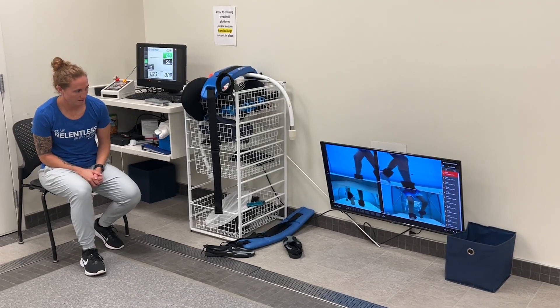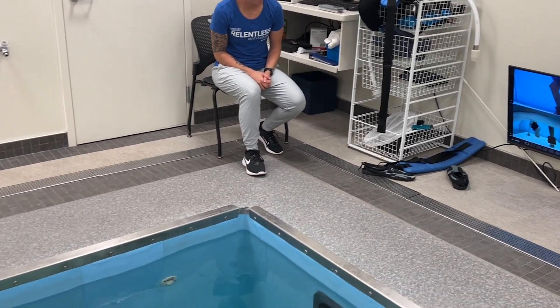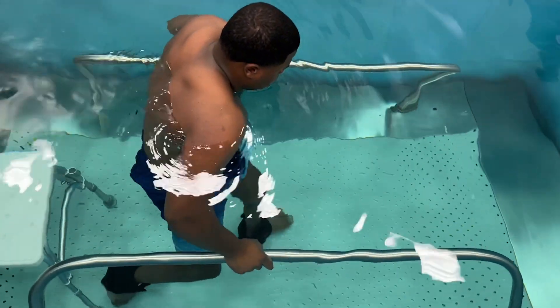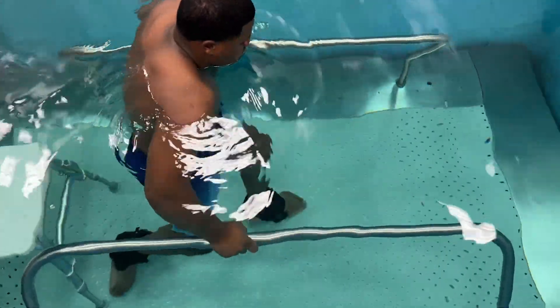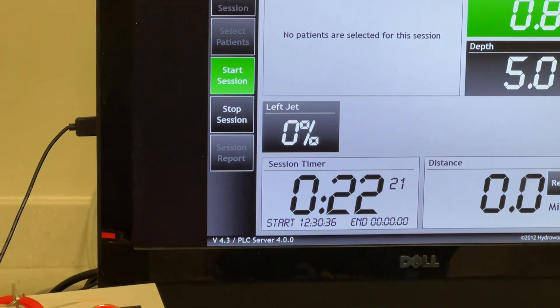Our next stop is the HydroWorks therapy pool. Hi, I'm Sam, an exercise specialist here at QLI. Hi, my name is Arindian. I'm in the HydroWorks pool gaining strength so I can walk independently again. It is a water therapy that decreases gravity and increases buoyancy, so it's easier for someone to start walking again.